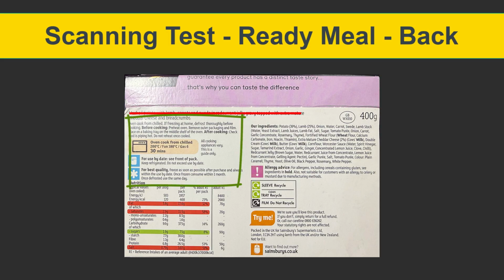OrCam was able to read the cooking instructions, though did make the occasional mistake misreading a word. However, the cooking instructions made sense, and the information about timing and oven temperatures were correct. I didn't use it to read the nutritional ingredients or allergen information.